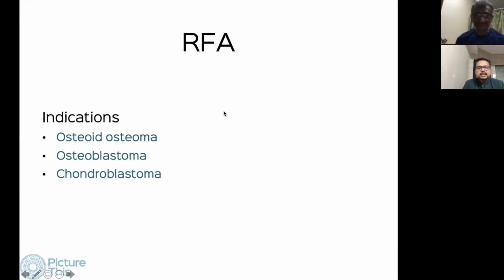Right. The second question, of course, is related to the neurovascular bundle and lesions around the spinal cord, around the nerve roots, and around nerves. How safe is radiofrequency ablation around nerve roots and around nerves in the spinal cord? So you have to keep a gap. With the Rita, the gap is supposed to be about 1 centimeter. And the challenge with the umbrella electrode is that it requires a shielded needle. Anything along the path of the needle also, you need to make sure you're reasonably far away from the neurovascular bundle. While people have used 10 millimeters, you can get away with 5.